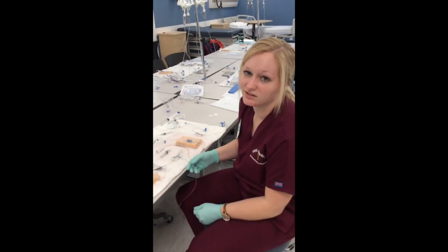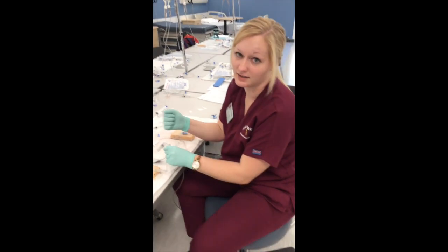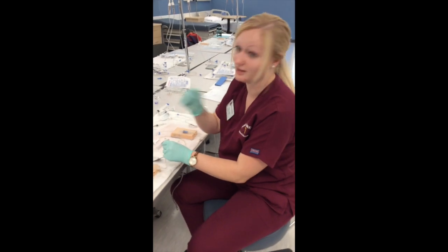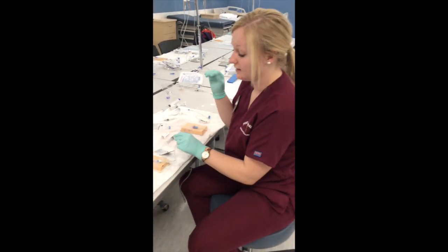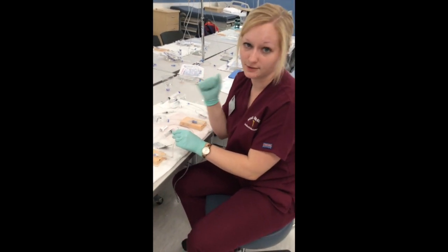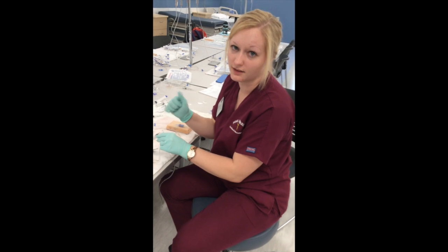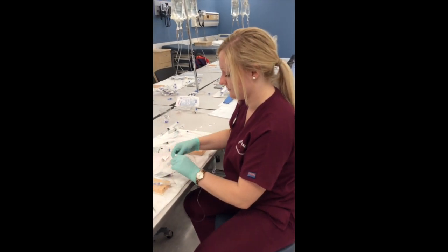I guess I don't really need to flush. Oh no, I do need to flush it. It's really important to flush it because I need to flush it over 5 minutes, the same as the morphine. So that is really important, sorry. So like I said, get my flush. I'm going to flush it over 5 minutes, the same rate that I administered the medication. And then I can unclamp it and let it go.